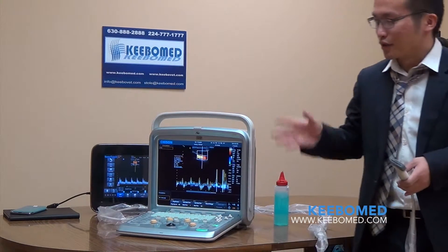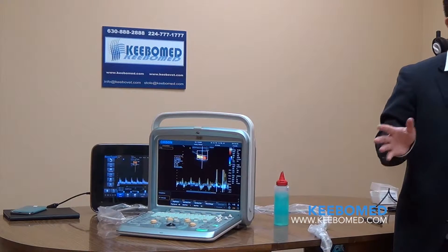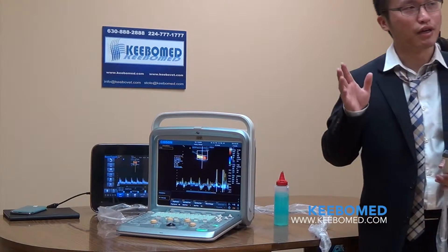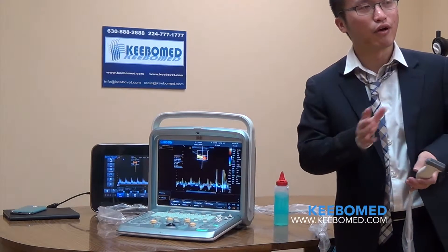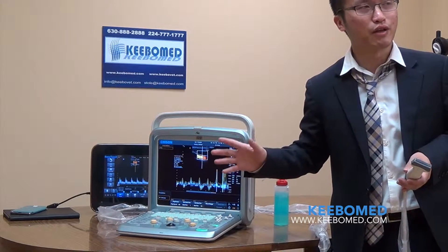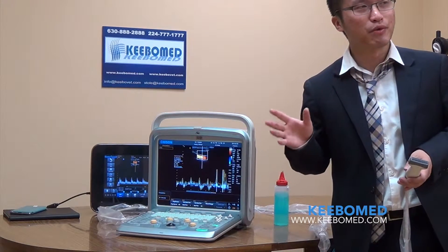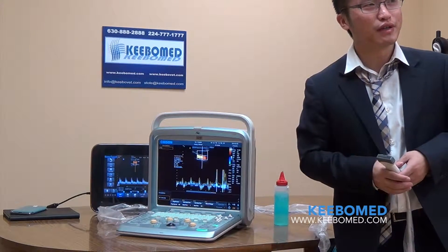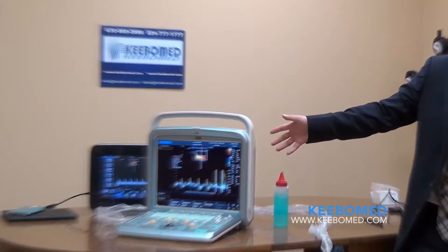The Q9 also has additional new functions including BBC mode, triplex mode, elastography, and ECG support. So in summary, the Q9 offers significant upgrades over the Q5 with these expanded imaging modes and clinical application support. Thank you.